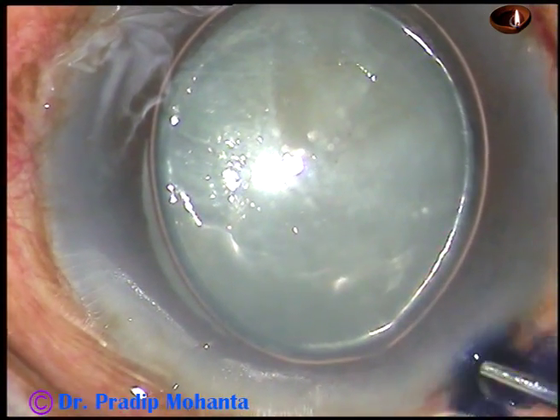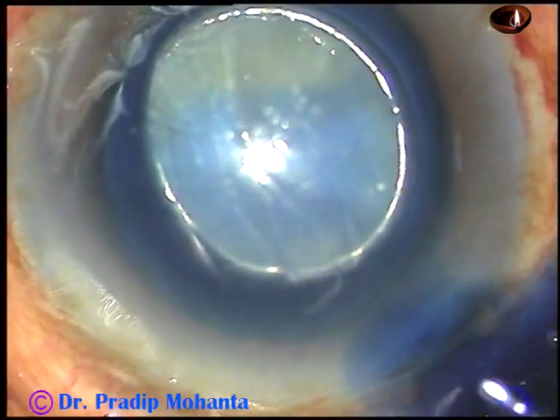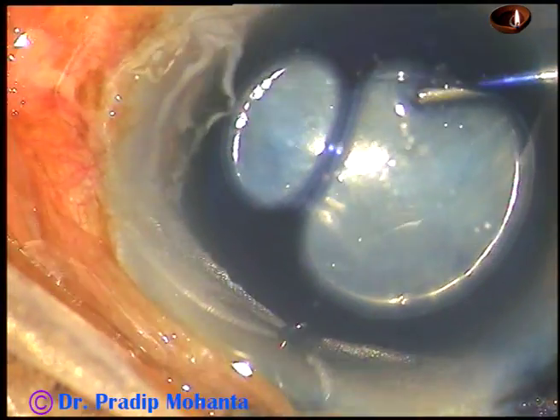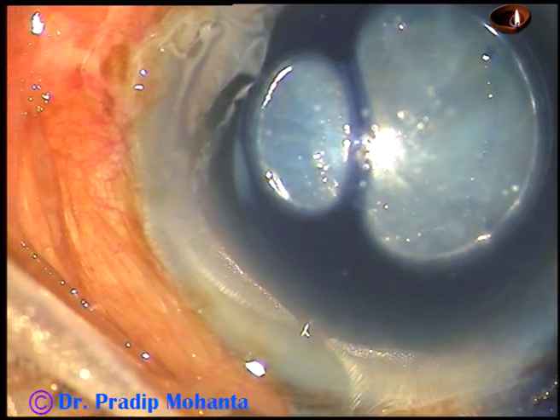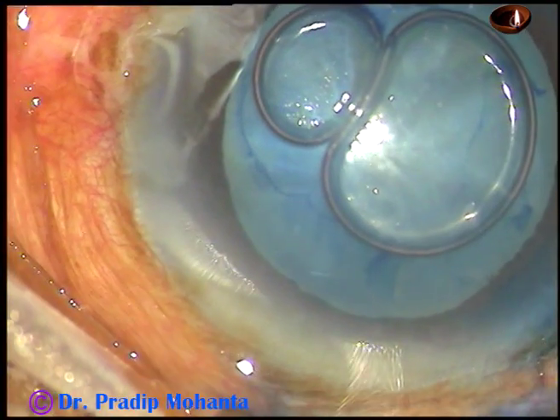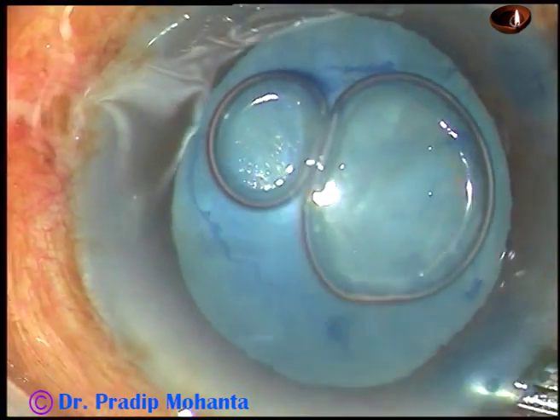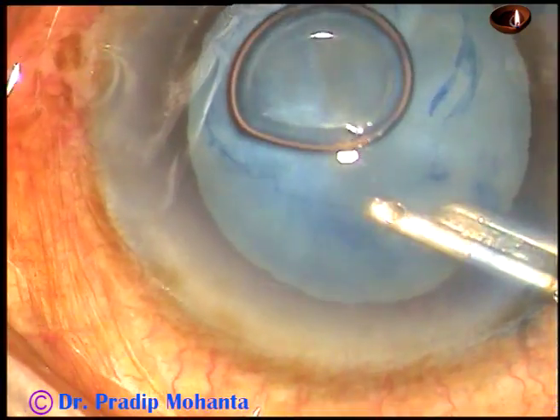Now I am injecting trypan blue dye, injecting through the side port for the inferior part. And now this is a little bit of adrenalin. The dye is then washed out using a 23-gauge Simcoe cannula.